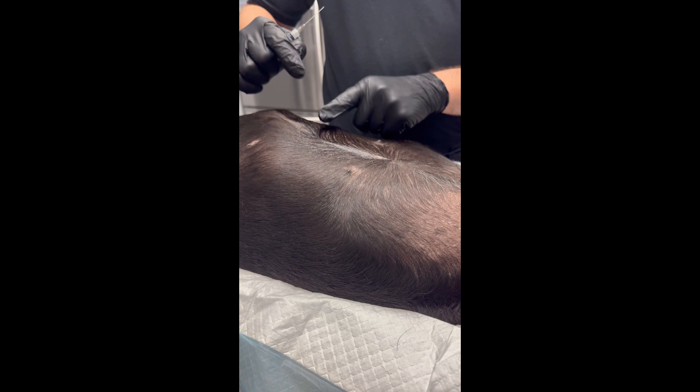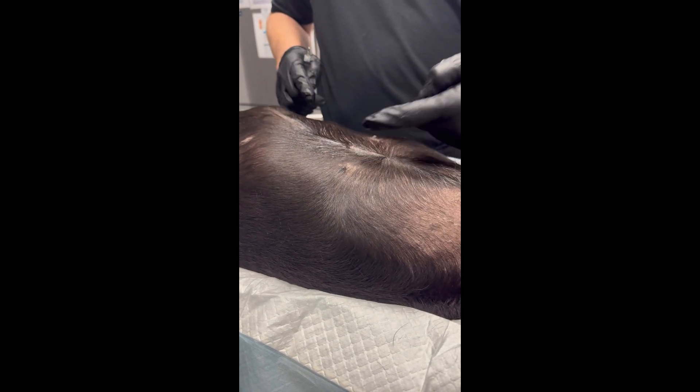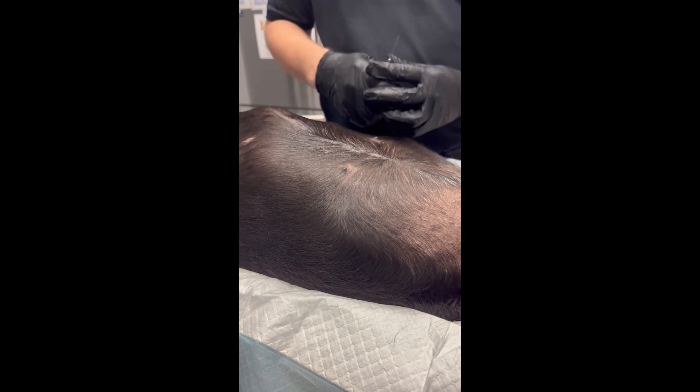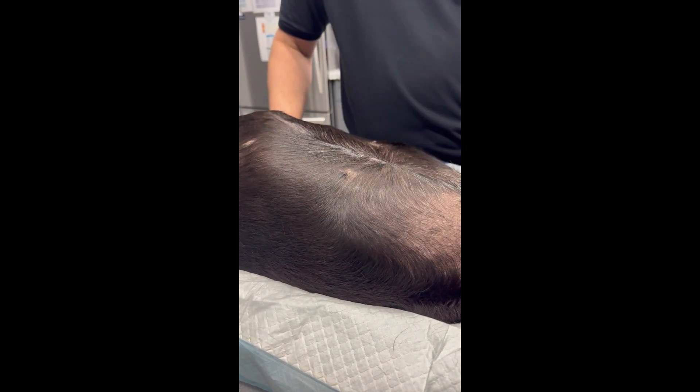These guys do really well. You can go in the direction I did, or sometimes you can go from the umbilicus back cranially as well — those are two options. The trough is a good way, or just laying on the side is another way.